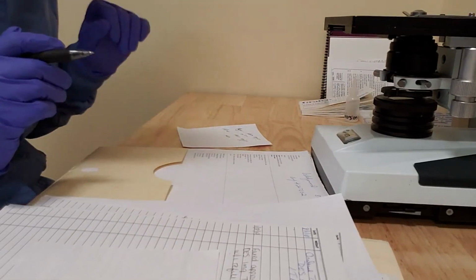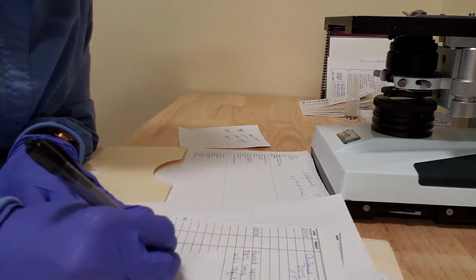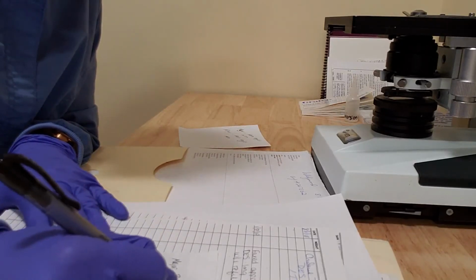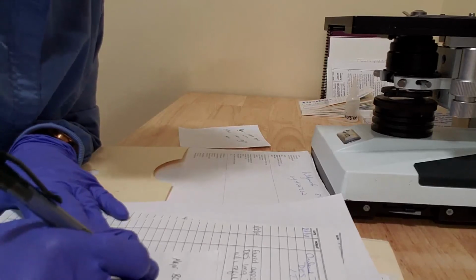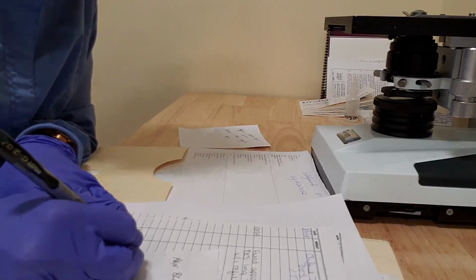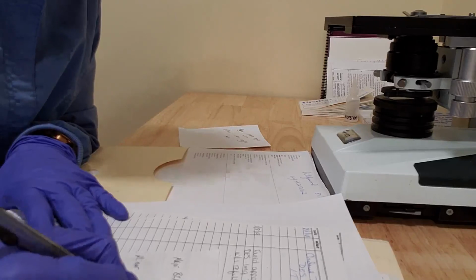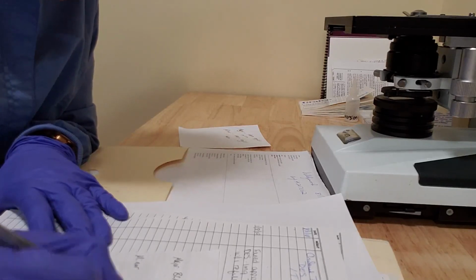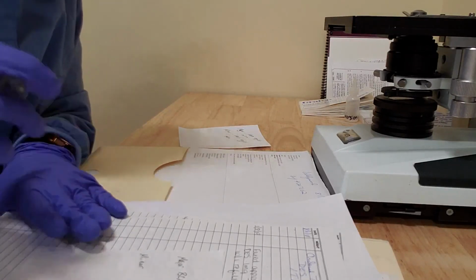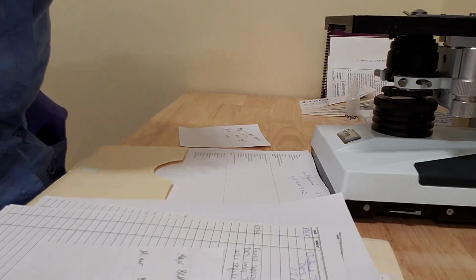Okay, so now that we've done our observations and we've taken our notes, we want to write it down in the record. So we want to write major BCM had both macroscopic agglutination and microscopic agglutination. And we want to do our minor BCM was the same thing, macroscopic agglutination and microscopic agglutination. So now that we've recorded this, that they are not a match, we would be all set.